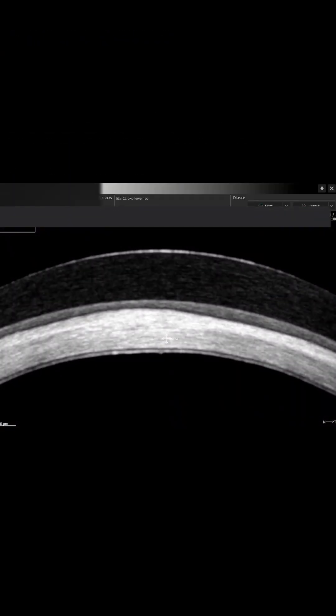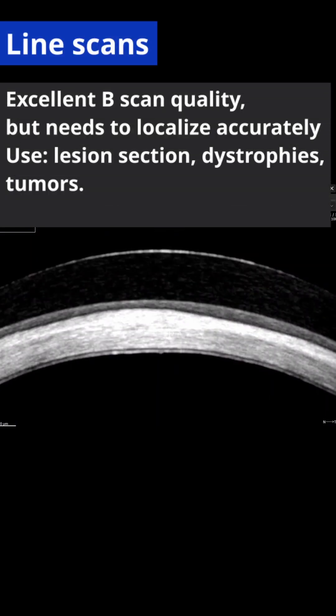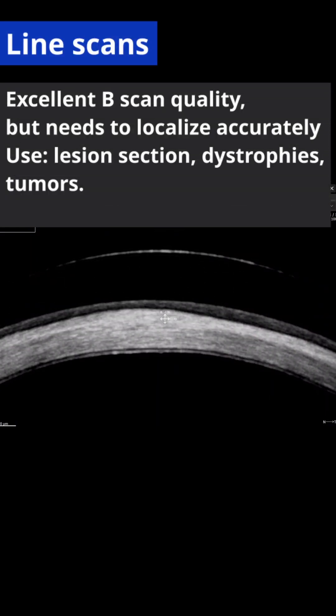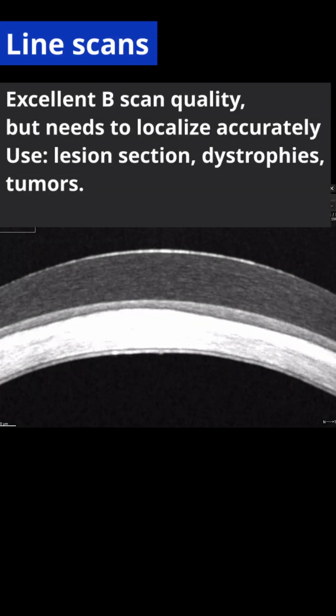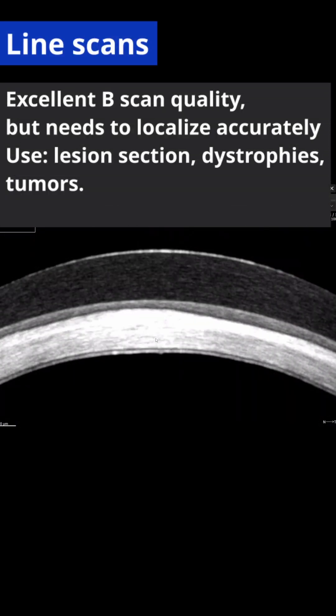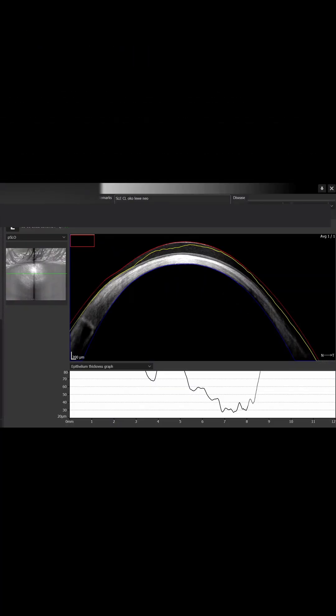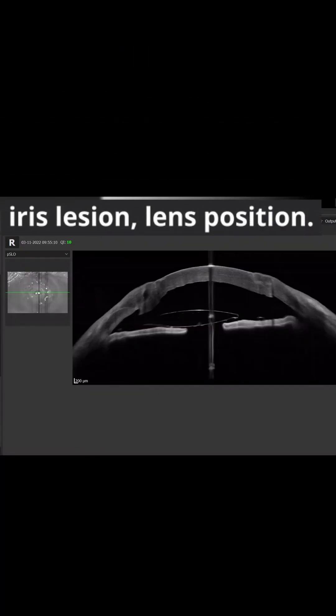The line scan has the highest quality, but you need to localize the lesion accurately. So it is most useful for tumors and dystrophies.